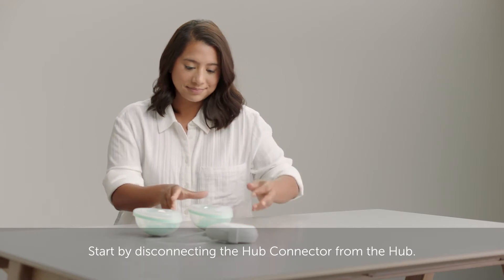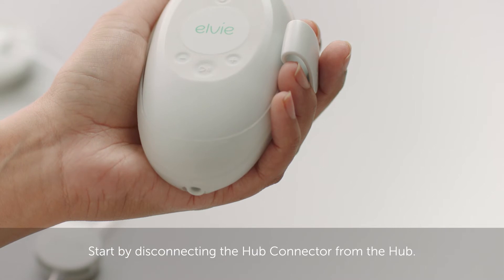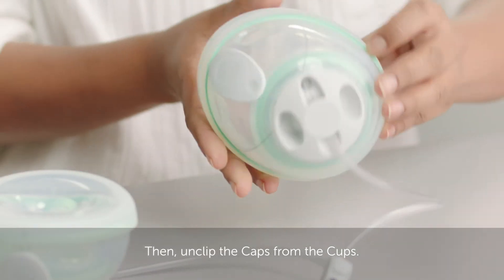Start by disconnecting the hub connector from the hub, then unclip the caps from the cups.